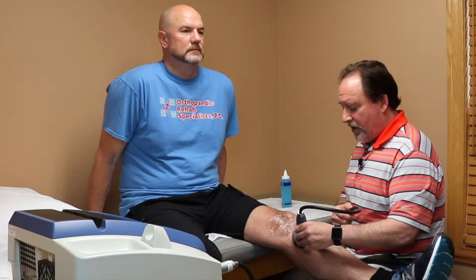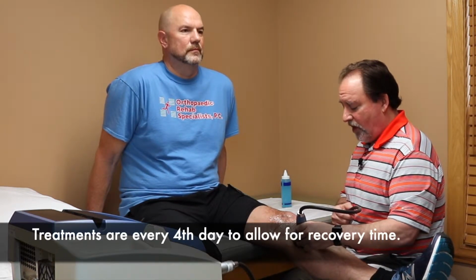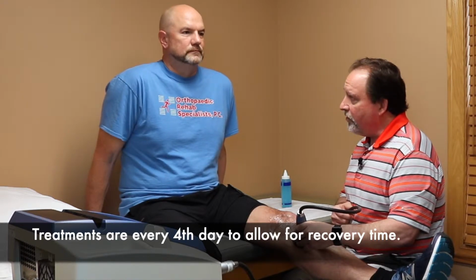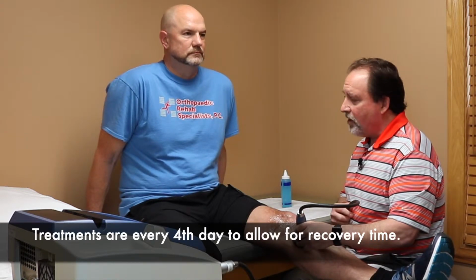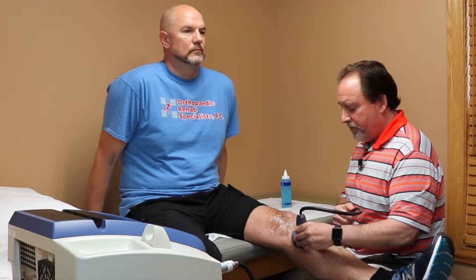These treatments can be done every fourth day because it is a shock to the tissues. You do need two or three days for that to calm down a little bit, but then on that third or fourth day is when you really go, wow, this is the best my knees have felt in months. And that's what we see.